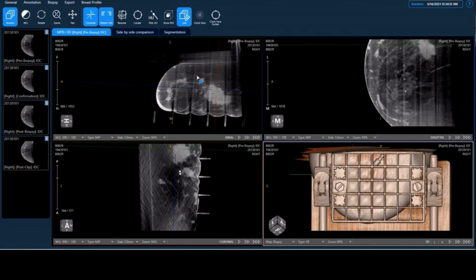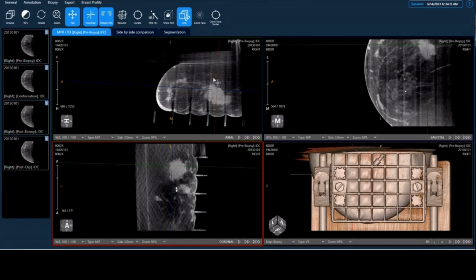It's just much faster. The first scan is a pre-biopsy scan. It helps locate the lesion. Once we find the lesion, in this case, there's a lesion that's ready to be biopsied. The breast is already stabilized by the grid. As you can see, this is a grid, and there's a back plate in the back. And we locate the lesion by going through the slices.